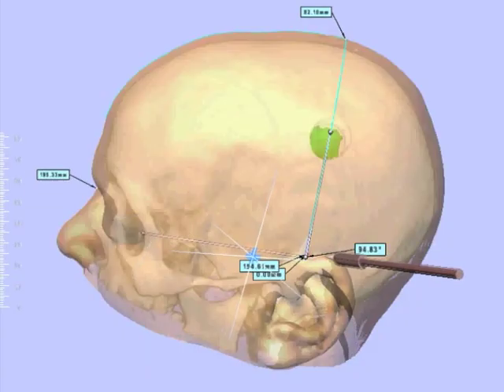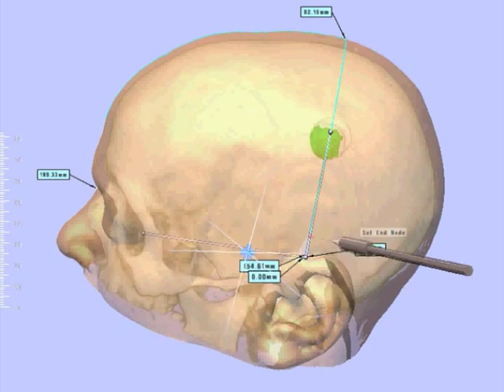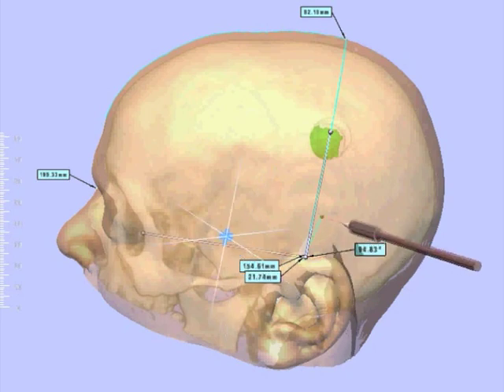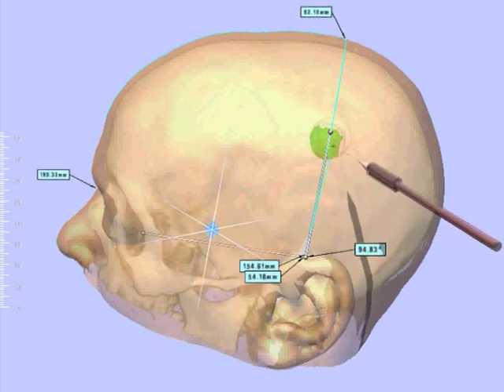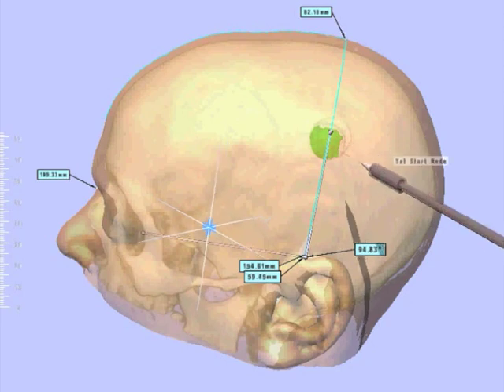On this additional auxiliary line, we then measure the distance to the center of our craniotomy, which is 5.9 cm.